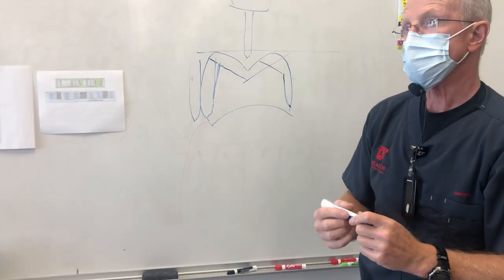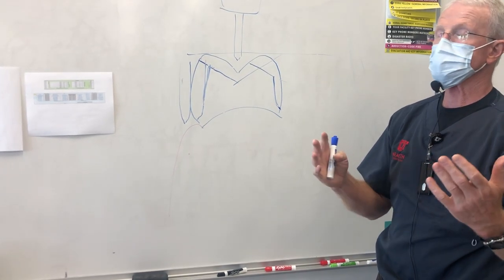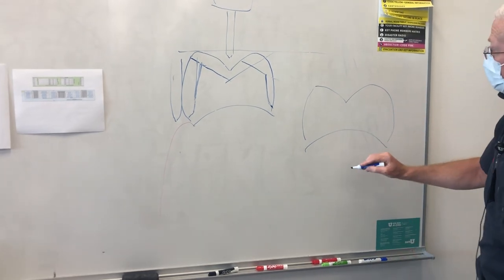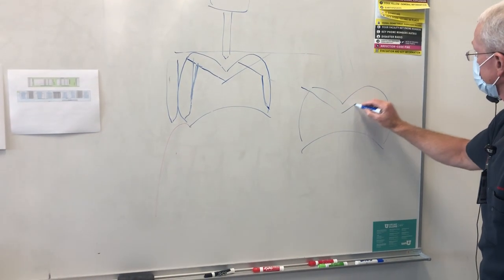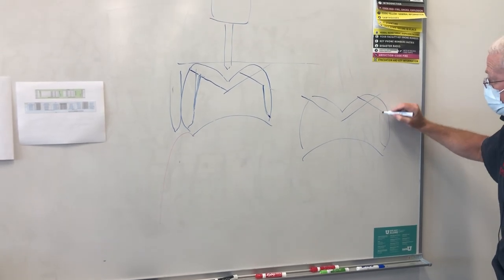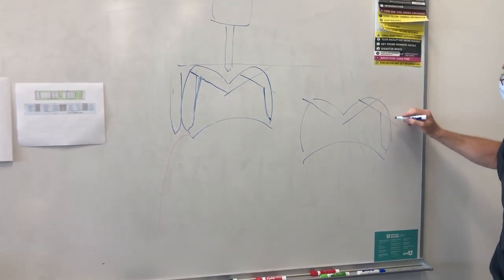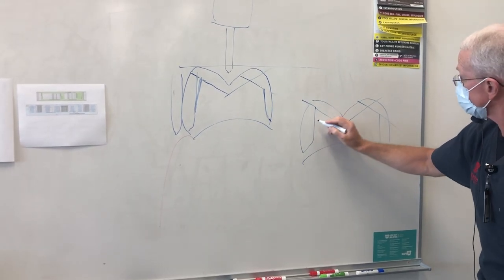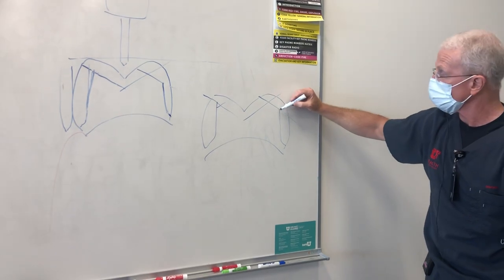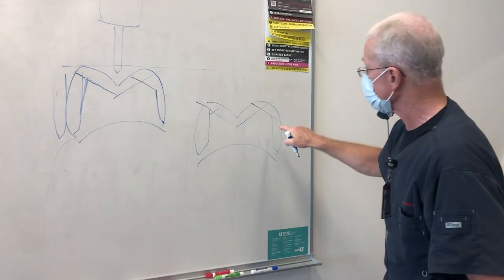So why didn't we do that on the mandibular? Is that just because the contour of the maxillary tooth is more bell-shaped? It's an excellent question. On the mandible, here's your lingual cusp, here's your buccal cusp. You do your occlusal reduction, including the functional cusp bevel, and then you line up your buccal axial wall exactly the same way, with the overall axis of the tooth. By the time you do your axial wall, the lingual, your non-functional cusp bevel, the functional cusp bevel takes into account that two-plane facial reduction. It's a great question.